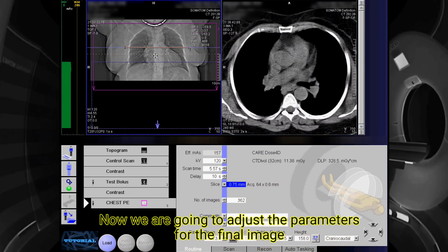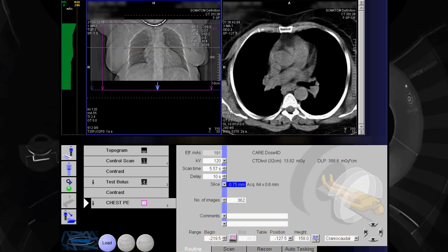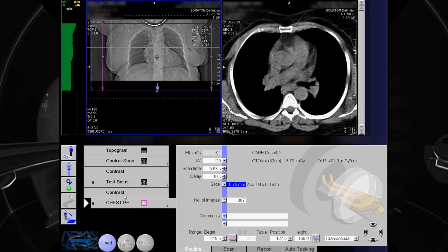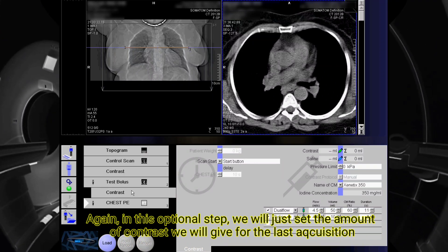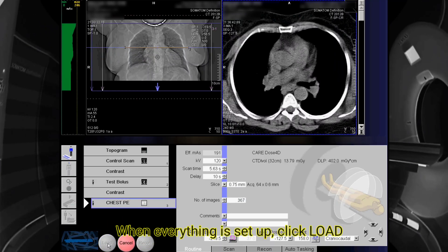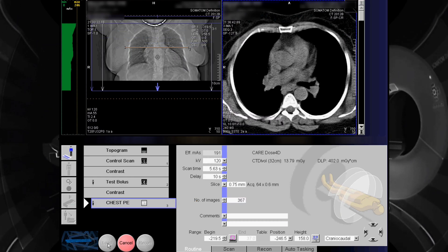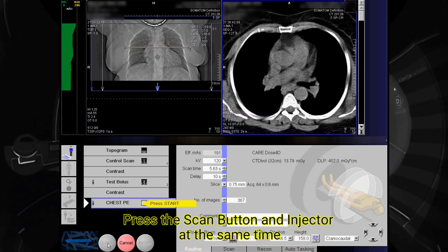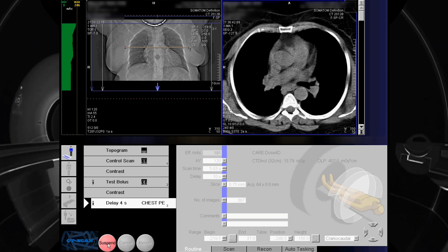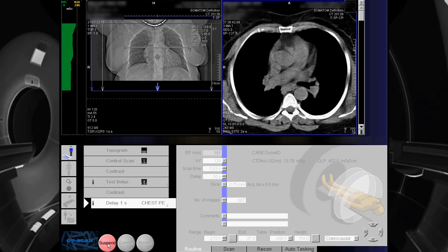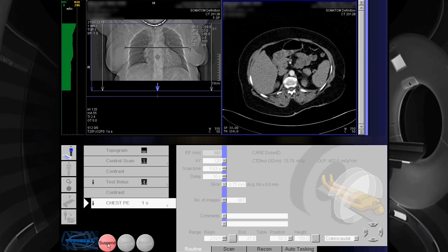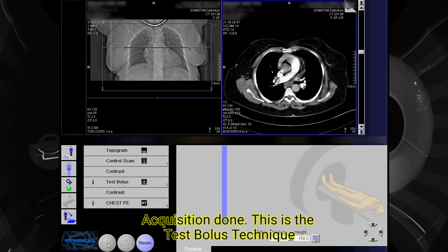Now we are going to adjust the parameters for the final image. Again, in this optional step, we will just set the amount of contrast we will use for the last acquisition. When everything is set up, click load. Press the scan button and injector at the same time. Acquisition done. This is the test bolus technique.